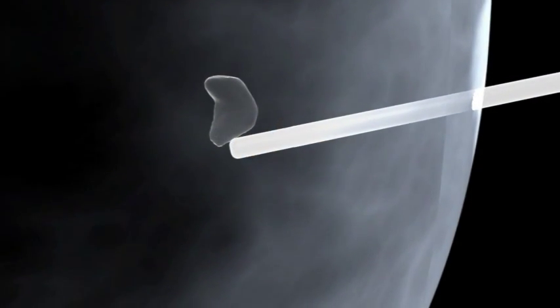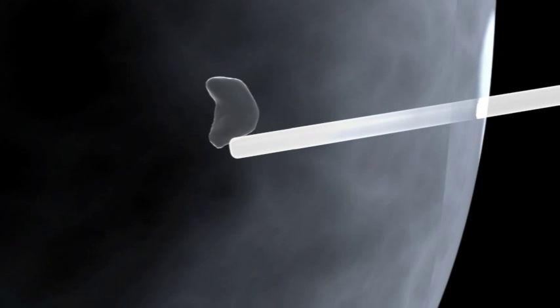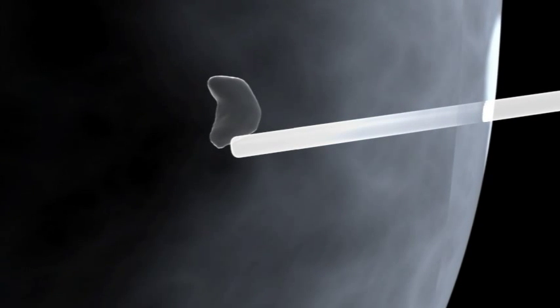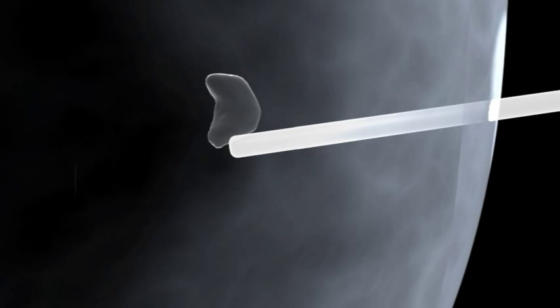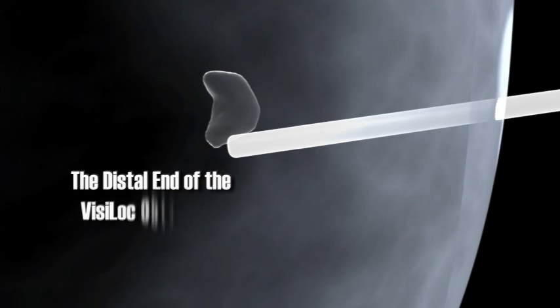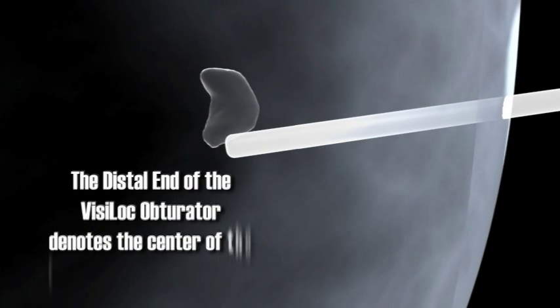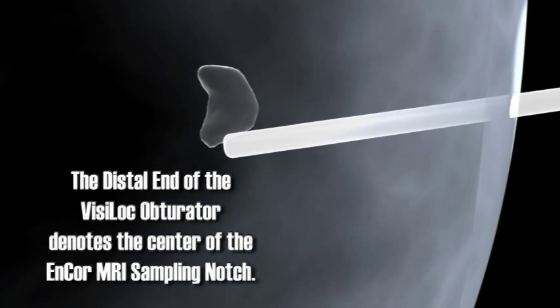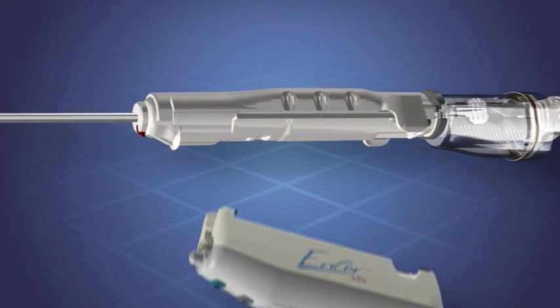Once the Viziloc obturator is in place, the patient is re-imaged. The resulting images should provide confirmation of precise targeting. The distal end of the Viziloc obturator denotes the center of the Encore MRI sampling notch.